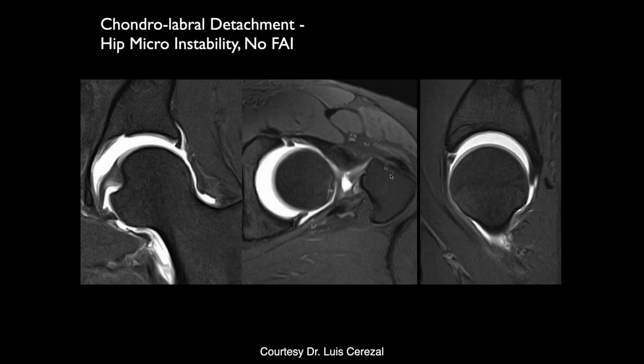Yeah. And this was called a chondrolabral detachment or a superior labral tear. And it's a cause of some instability. The issue up here, you can also get normal chondrolabral separations here or clefts in the superior labrum as well. And when they're very smooth like this, the majority of the time, the arthroscopist will call these normal variants. So when you see this, I would describe it and say it's most likely a chondrolabral separation, a congenital chondrolabral defect, but a labral tear cannot be excluded. If you see it going all the way through, as we see in these, then that's evidence of a tear, not just a normal variant.